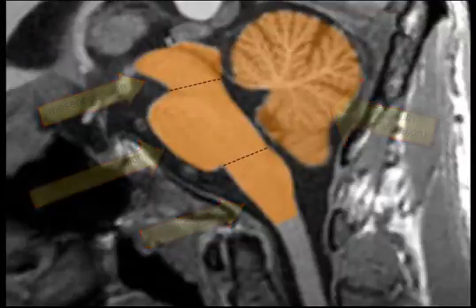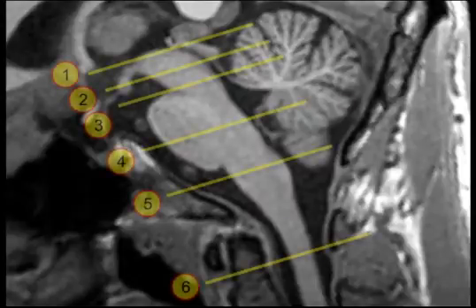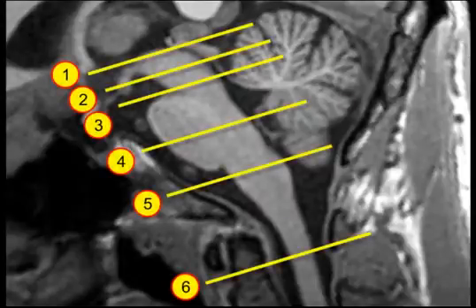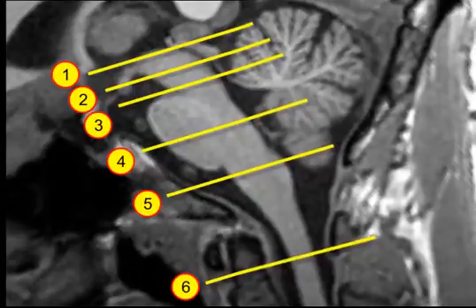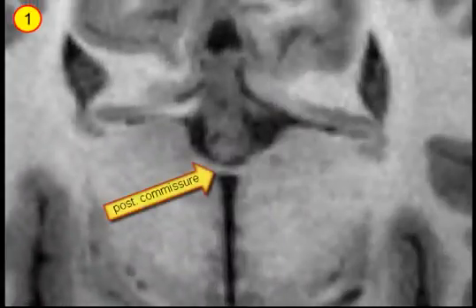We will now go to a series of horizontal MRIs and stop at the levels indicated. We start a horizontal sequence at the posterior commissure, which marks the superior boundary of the mesencephalon.